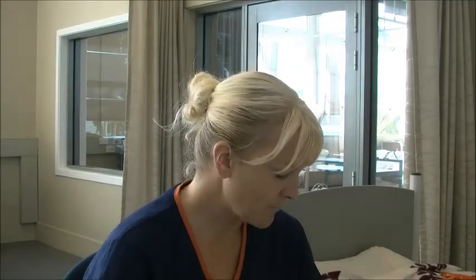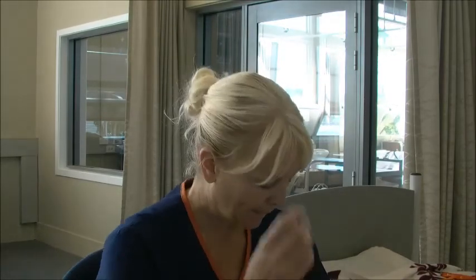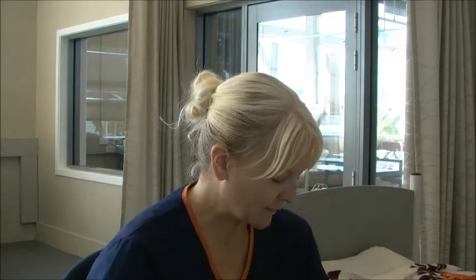The documentation will, in this instance, be around the labels that you're putting onto the bag, that you're making sure that you're doing the 5 rights of medication administration, and that you're having someone check within the boundaries of what you can do as a student nurse. So make sure that you always have your RN checking before you're starting anything. You don't have to write in the medical notes, but you need to give a verbal handover of your patient.